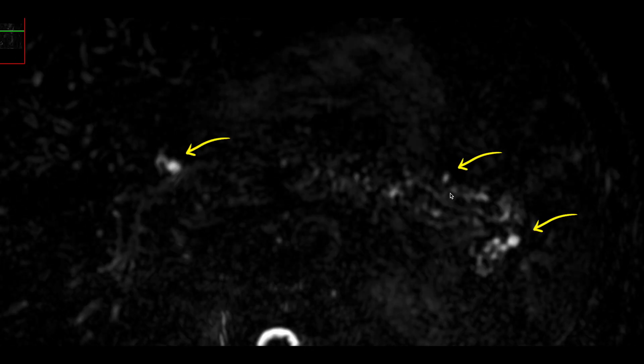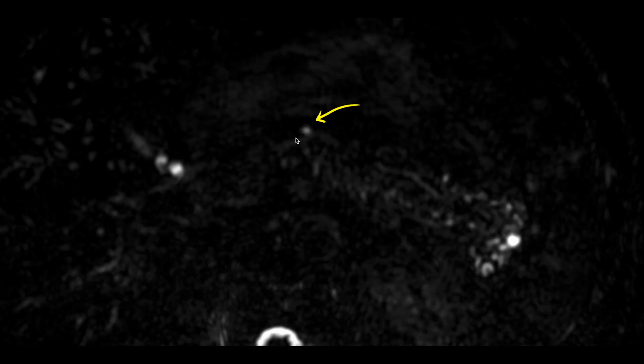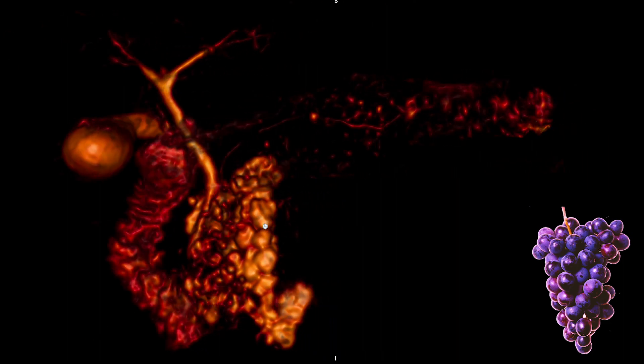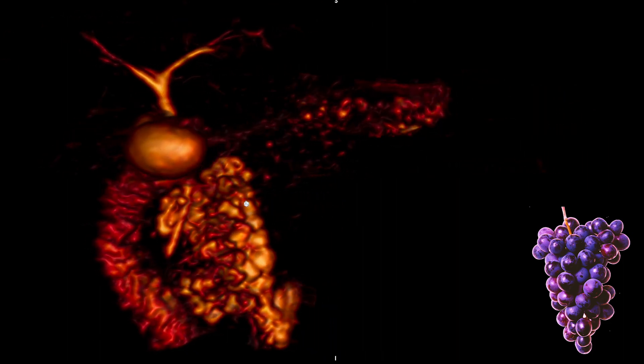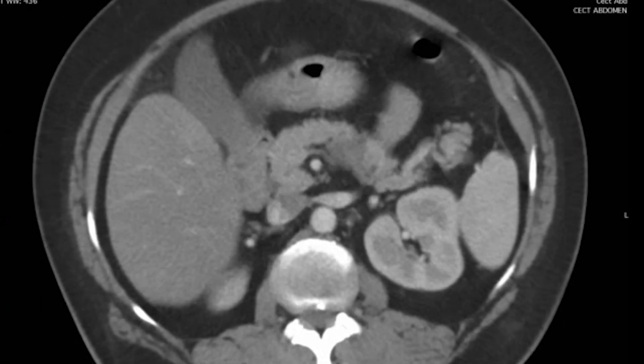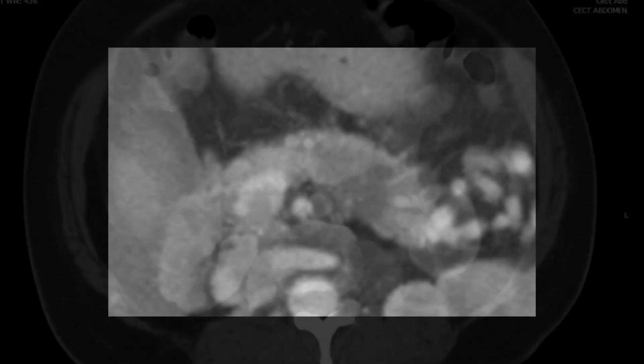A 40-year-old asymptomatic male patient underwent MRCP. You can see the pancreatic duct and saccular outpouchings in the tail region and in the body region. Coronal MRCP shows the pancreatic duct communication within a large IPMN. These are IPMNs in the region of the head and uncinate process, which can be compared with a bunch of grapes. Another case shows a hypodense lesion in the body of the pancreas, proven to be IPMN.